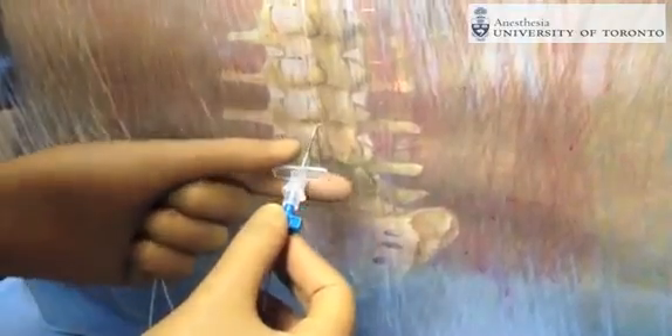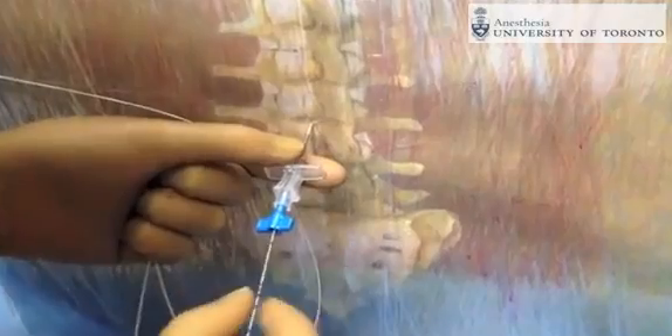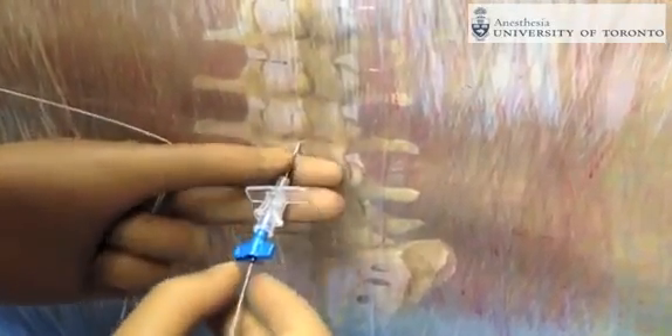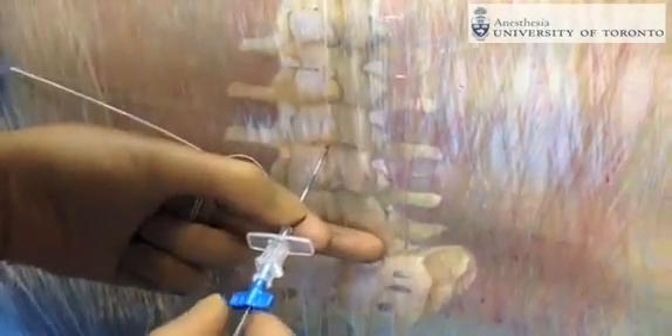The epidural catheter is threaded into the epidural space. Once the epidural catheter has been threaded, the needle is withdrawn while holding the epidural catheter in place.